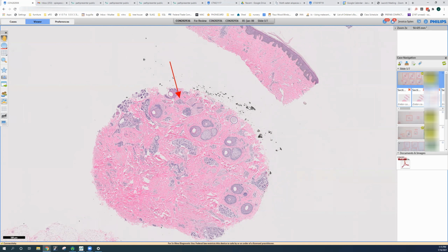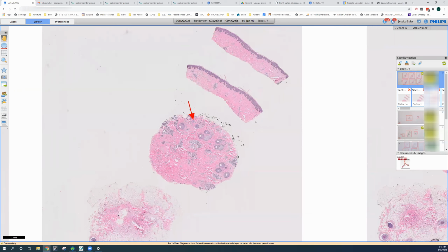Just to note, up to 7% of secondary syphilis patients have syphilitic alopecia. And it may be patchy or moth-eaten or diffuse or show both patterns of hair loss. In this case, it was patchy. So let's go over the histology for this case, which is really a beautiful example of syphilitic alopecia. The histology is not specific, but it may suggest a diagnosis.